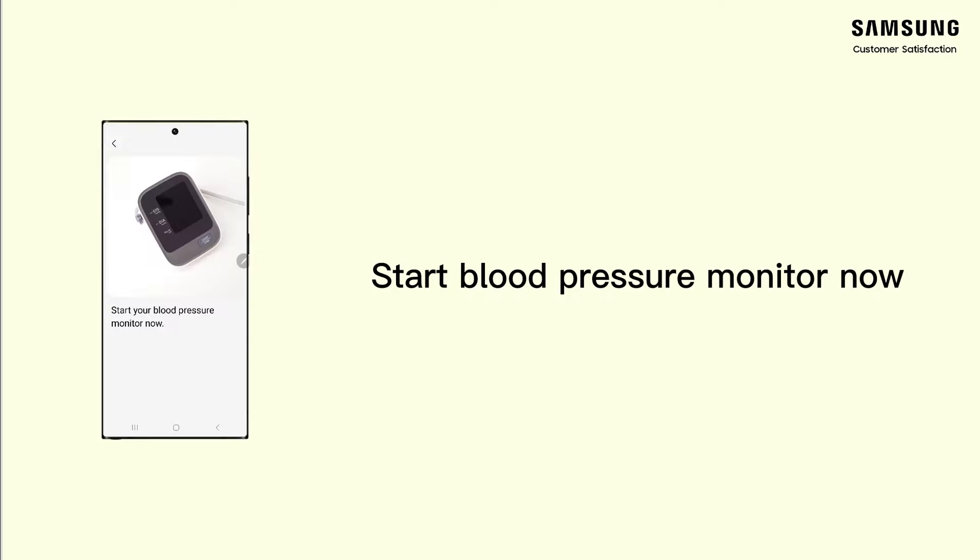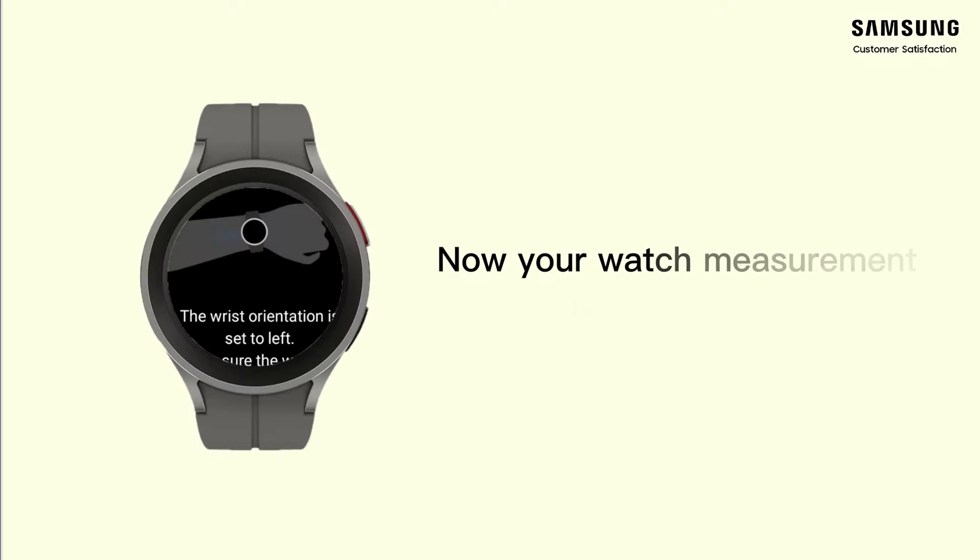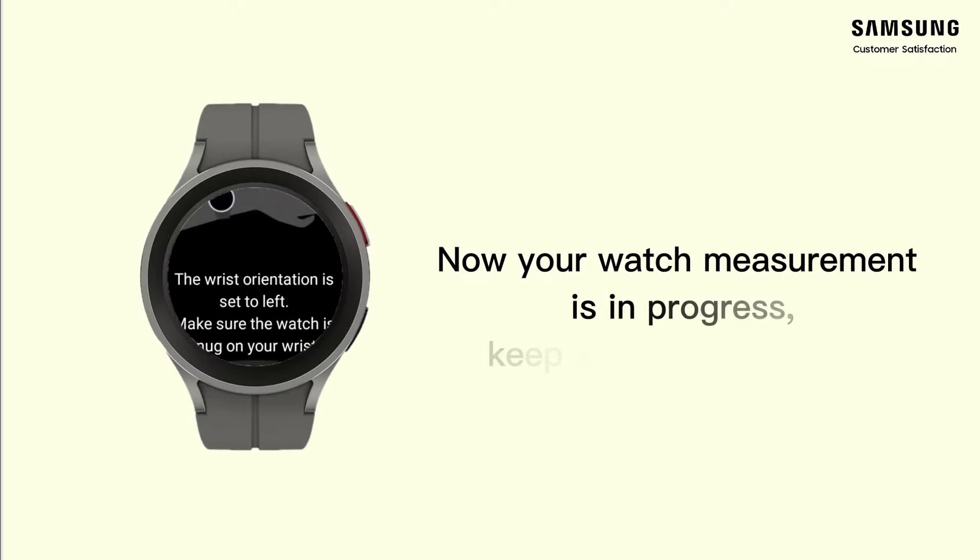Start blood pressure monitor now and your watch will start measuring automatically in 10 seconds. Now your watch measurement is in progress — keep sitting and relaxing.